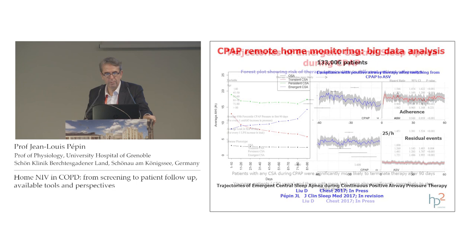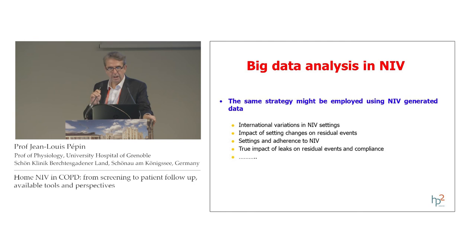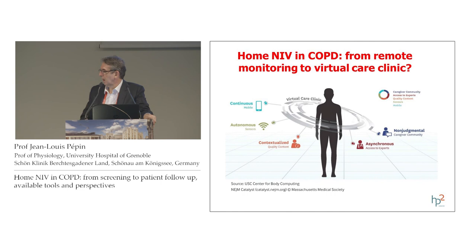With big data analysis in non-invasive ventilation, we have the potential to get a lot of information because we have many, many very small studies involving at maximum some 100 patients. We have international variation in NIV settings, and using this big data analysis, probably we can get the impact of different settings and changes in settings on residual events. We can look at the relationship between settings and adherence to NIV, and also the true impact of leaks on residual events and compliance.